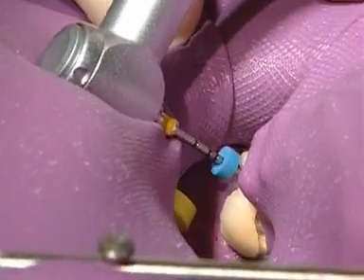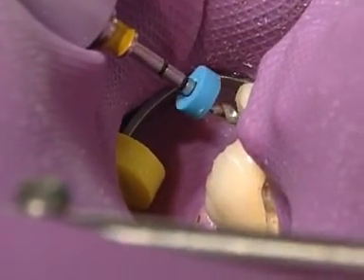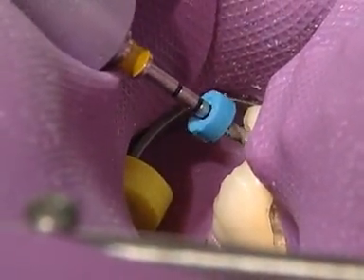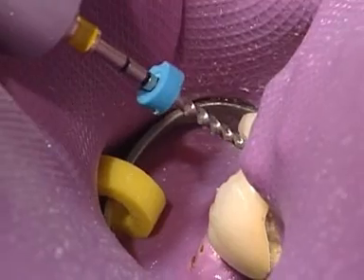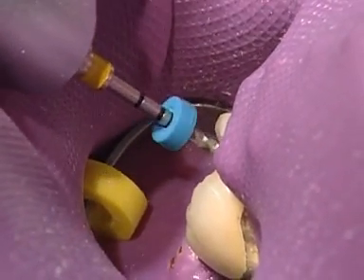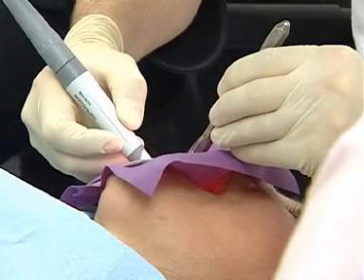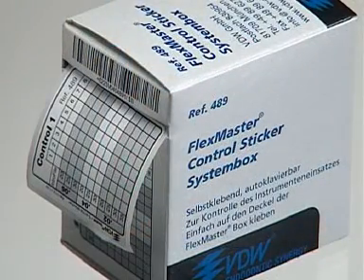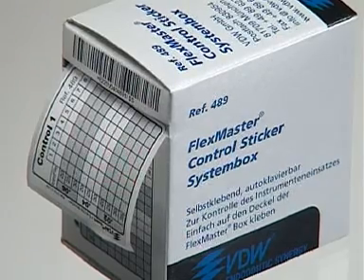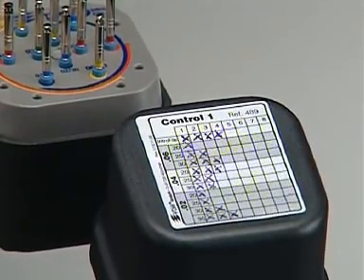Preparation is continued with the 0620. With the auto-stop reverse function, the unit automatically rotates in reverse direction when the programmed torque limit is reached. If a file is blocked, it oscillates between forward and reverse rotation until the file is released, an additional measure against instrument fracture. The microscope optimizes working precision. The frequency with which an instrument is used should be recorded on the control sticker. In this way, you can check when it is time to stop using an instrument for safety reasons.